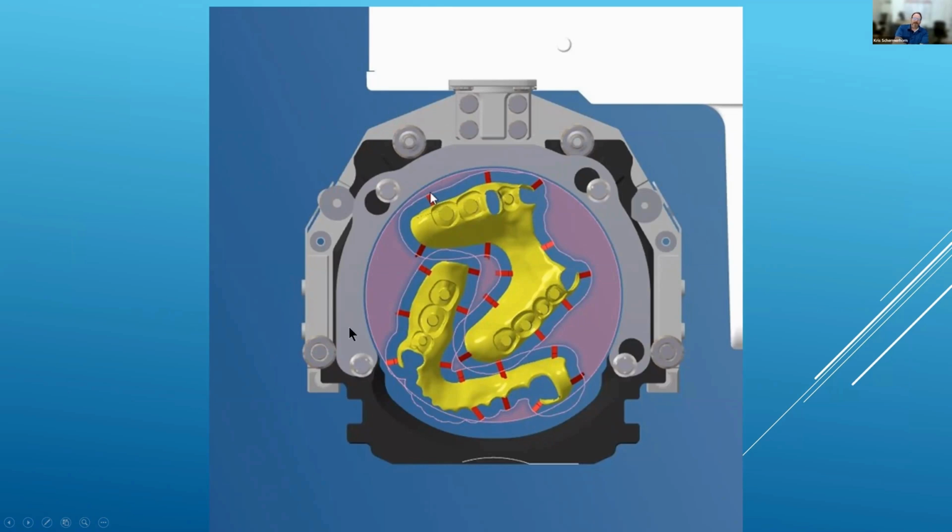process. One thing I will say, the 53 is kind of my workhorse with a lot of plastics. It was developed for the Roland 53DC, much more robust spindle than the 52, and a much more rigid mill. It also has the open edge bracket, which is nice. They kind of came up with the open edge brackets so that you could mill the facials of all on X cases and things like that.